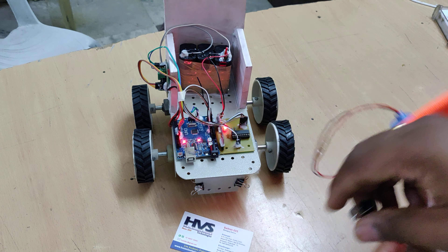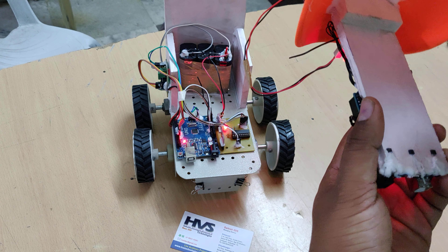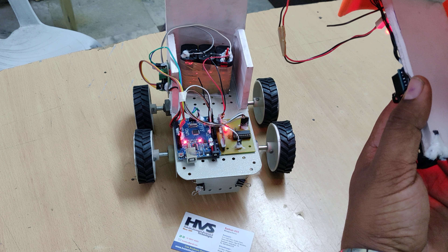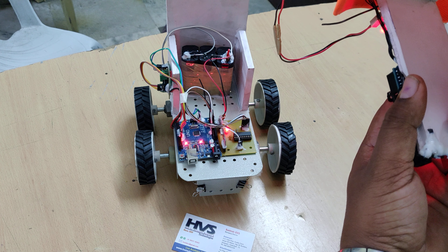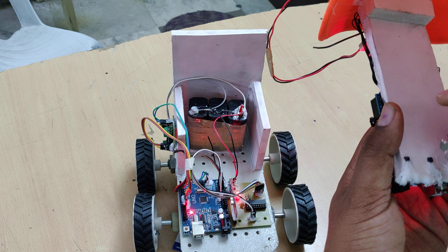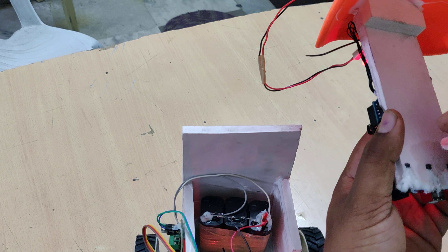This is the demonstration magnet. We are going to send two clips along with one magnet. When you show the magnet near the sensor, if it doesn't work, change the position. Replace it like this and it will work.